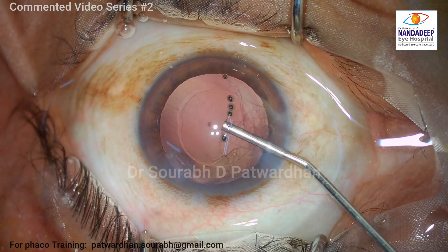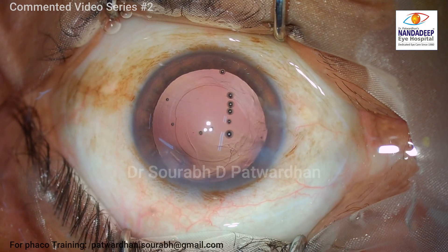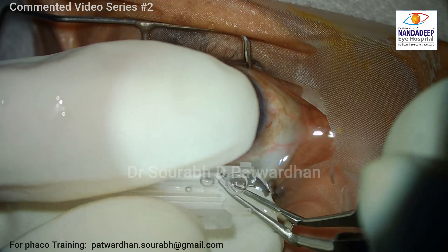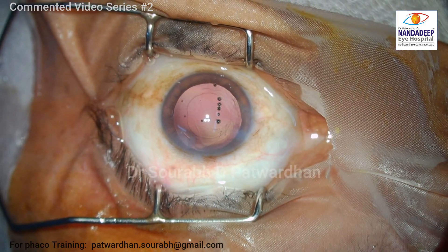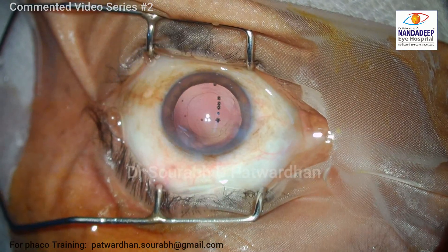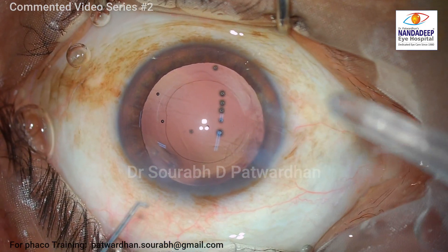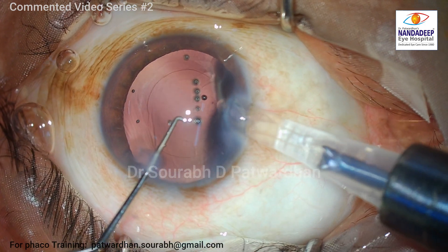The bag is inflated again with OVD, and what I noted here is that still the posterior capsule is not deep. That means the anatomy of this particular lens itself is different — maybe that is the anatomical variation of this eye. During the surgery, though I was of course more cautious about the posterior capsule, I didn't see any fluctuations. So though the lens thickness was less, there was no redundancy of the posterior capsule, which was good.